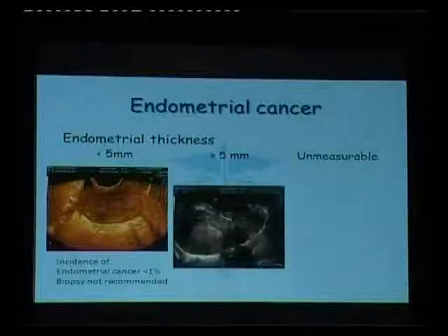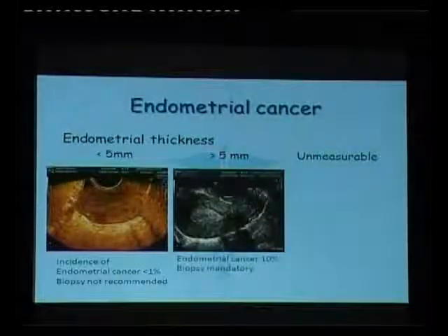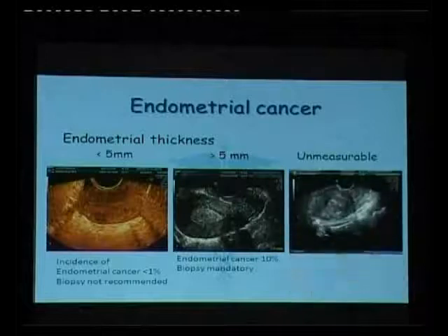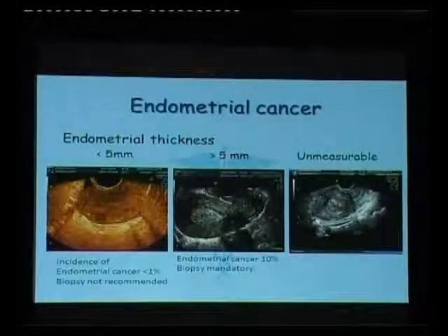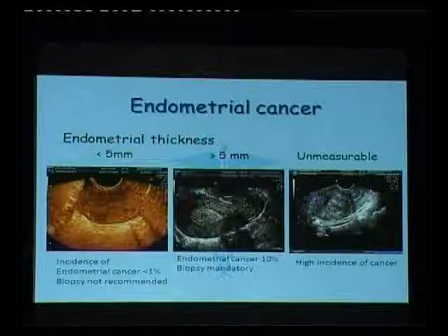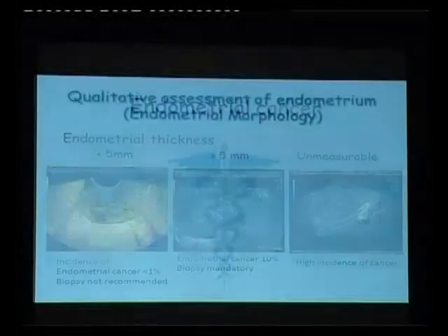Whereas whenever we find the endometrial thickness is more than 5 millimeters, these are the patients where the endometrial carcinoma incidence is almost about 10%, and the biopsy is mandatory. And in situations like this, where we have an unmeasurable or non-measurable endometrium, it is essential to note that there is a high incidence of cancer and endometrial biopsy has to be advocated. So this is the approach based on the endometrial thickness.